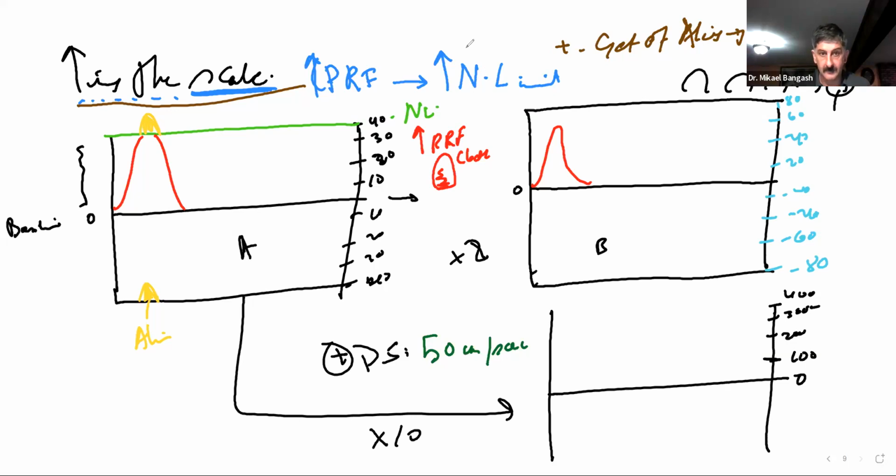Now we said, ladies, that the velocity of blood was still a positive Doppler shift of 50 centimeters per second. If you look at that, the graph is going to be like this. Because this level here, sorry, is 100. Your 50 centimeters is going to be somewhere here.